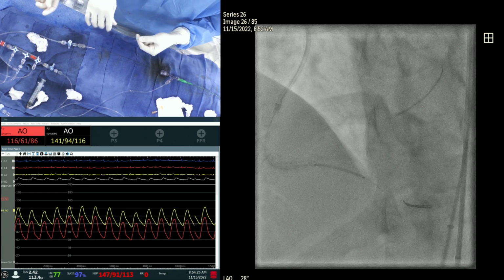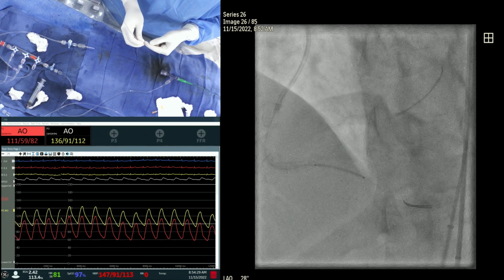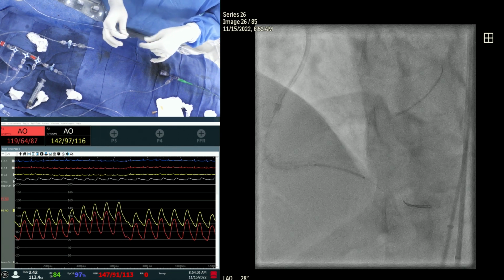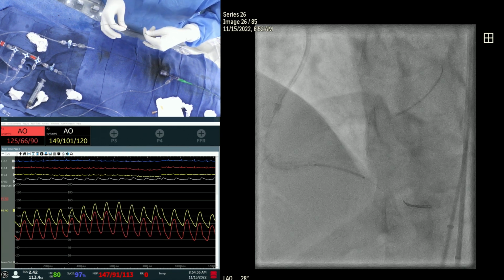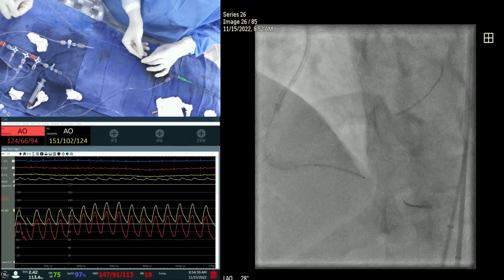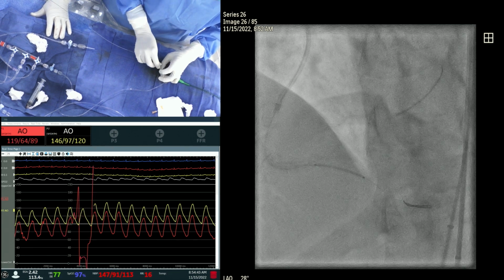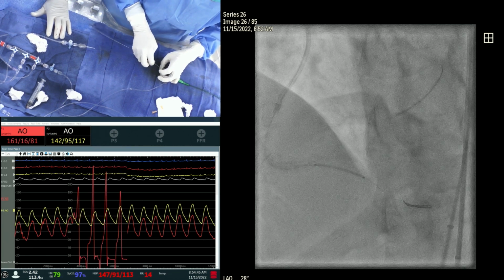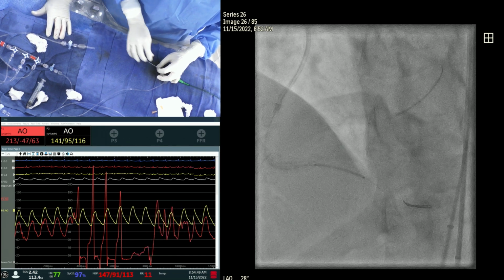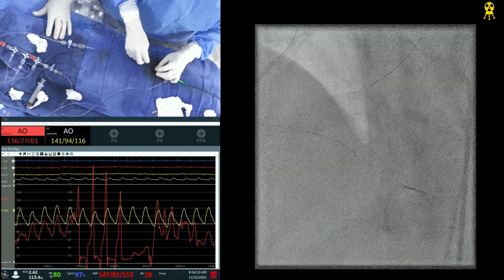Yeah. So our main, where the money is, the stent is in the right place. Now, can we get a second stent in the AV continuation? It's like a bonus. If we can get it, otherwise we can always do the step or reverse crush technique. Actually, it will be reverse crush if we need to go back into the AV continuation. Good. Keep seeing the fluoro because that's another important point. All your equipment, wires, all will go further.